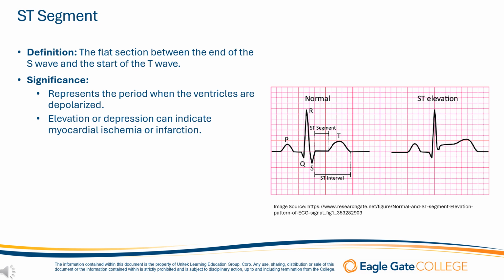ST elevation is seen as a rise above the baseline and can indicate myocardial infarction, or heart attack. This is often due to a complete blockage of a coronary artery, leading to injury of the heart muscle. ST elevation is a medical emergency and requires immediate attention and intervention.